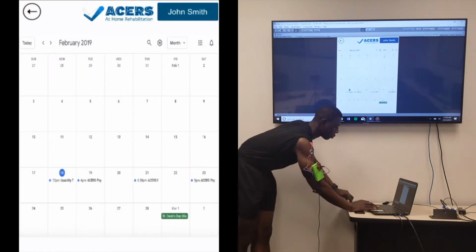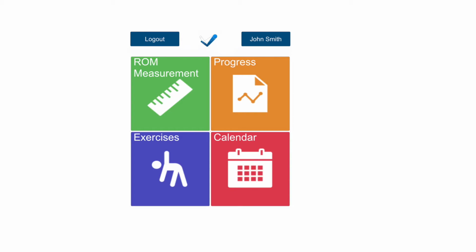Lastly, the patient can view their calendar to see their upcoming exercise plans. The full demo video can be viewed by clicking on the link in the box below.